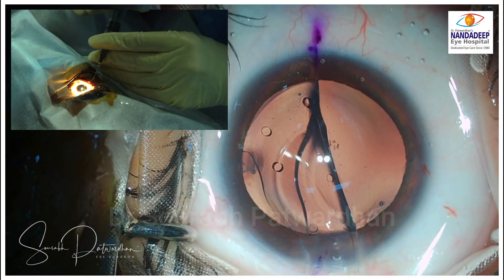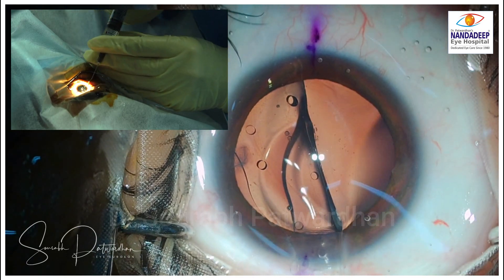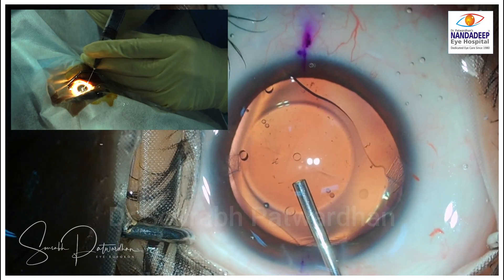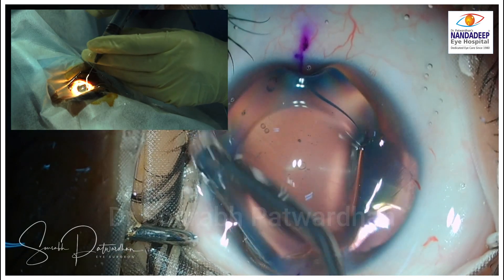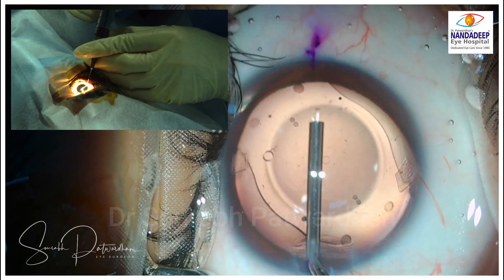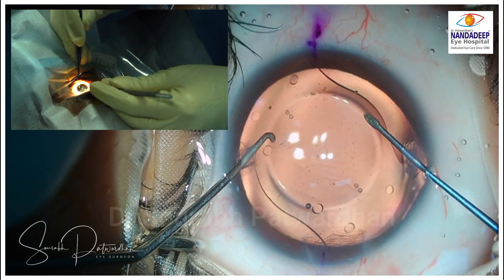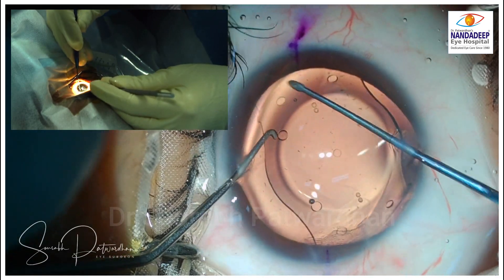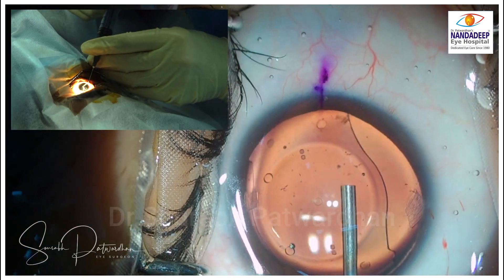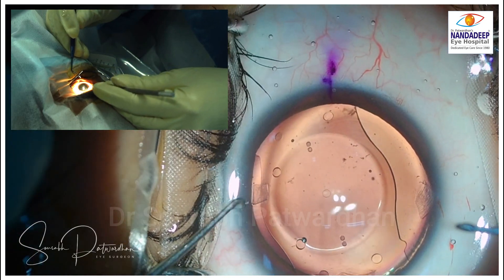Now the orientation is good. On the leading haptic you can see the knob is on the left side, and when I push the trailing haptic inside you can see its knob is on the right side — this is the perfect orientation we wanted. I showed you how to load the IPCL in the groove in the cartridge, and how to do the push-and-pull maneuver so that the trailing haptic is not caught in the plunger.